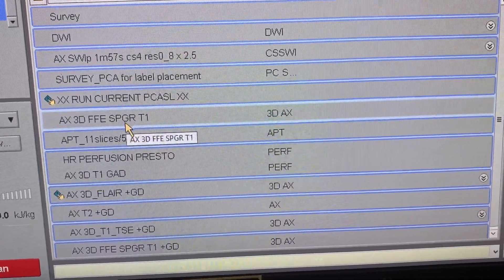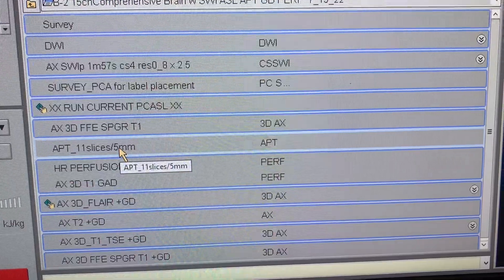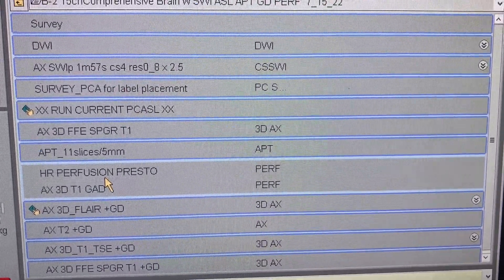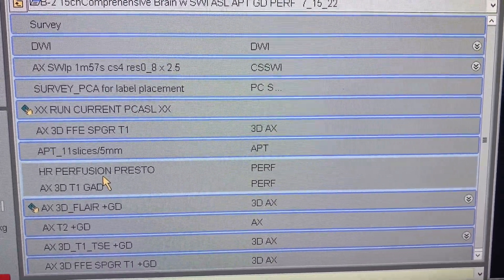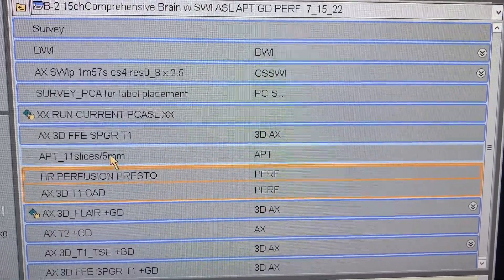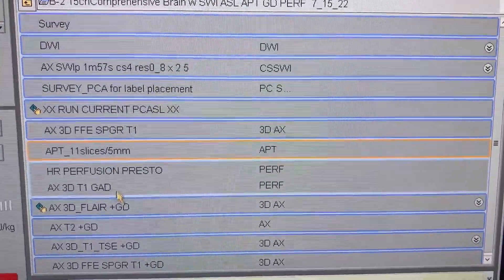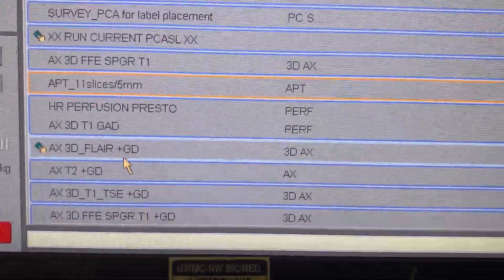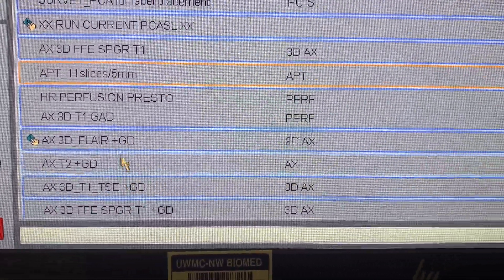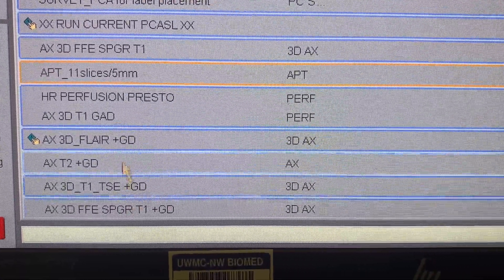The most important sequences we're going to look at today are the APT sequence and the high-resolution perfusion sequence. Those are the ones that require post-processing and require a certain setup. The rest of the sequences, especially post-contrast, are basically routine full-brain coverage.